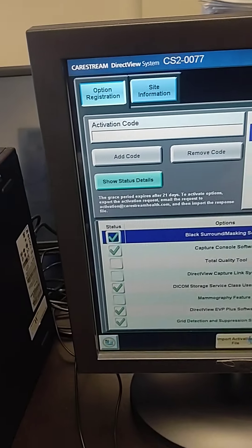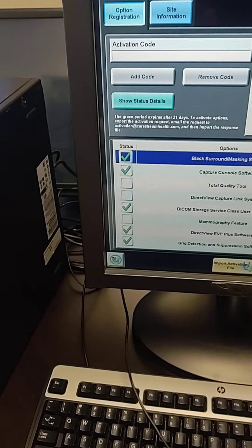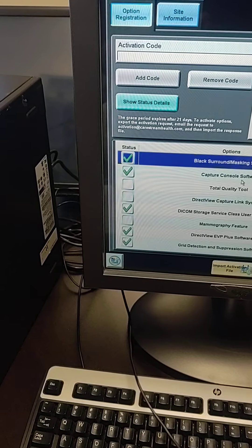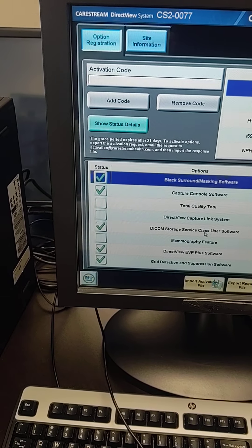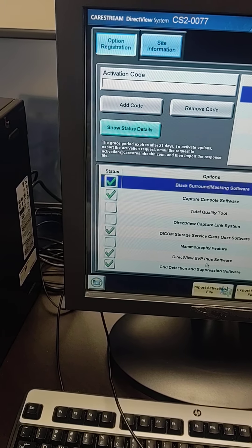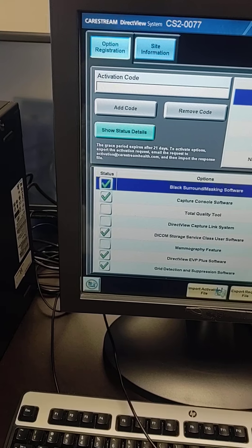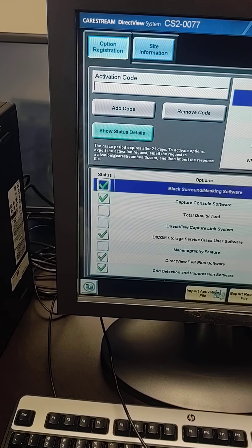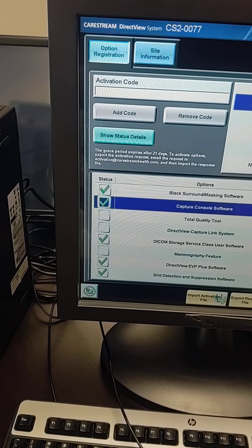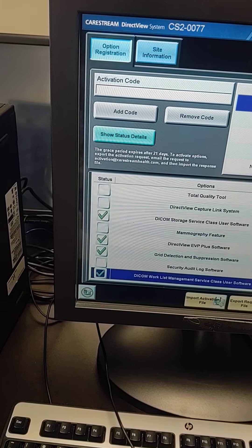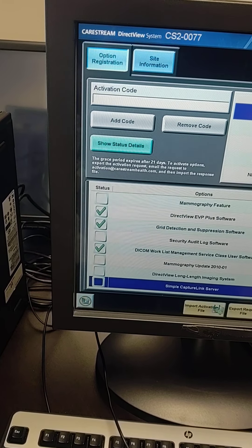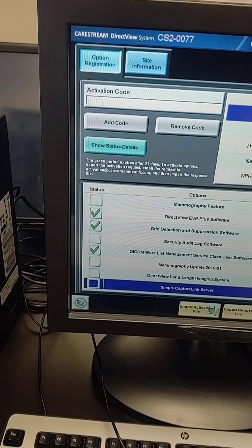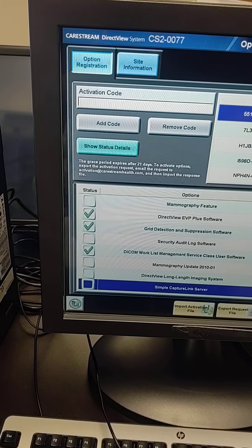Just so that you can see, you've got black surround masking, capture console, DICOM storage, EVP plus which improves the image quality, grid detection suppression. These really should be used with the 103 line pair grid.